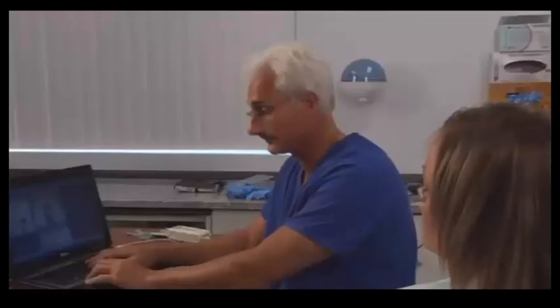Yes, now looking at the screen I can see why I have the muscle pain. Very good.